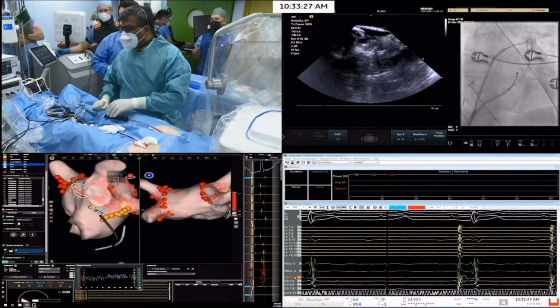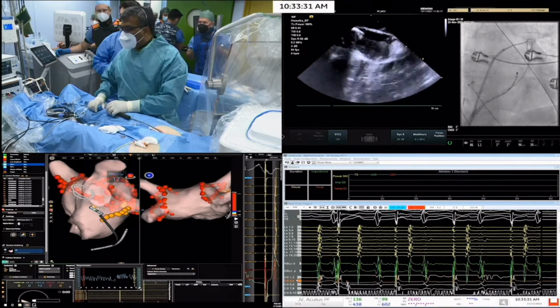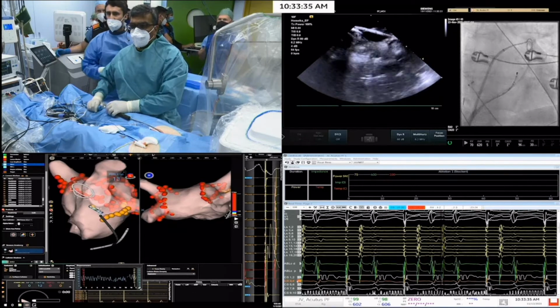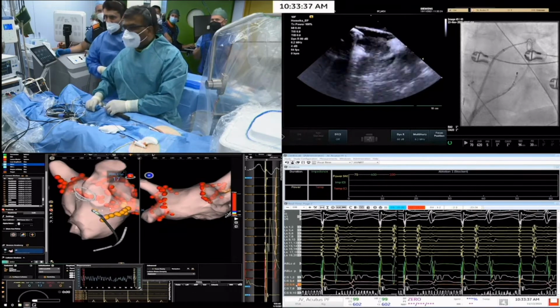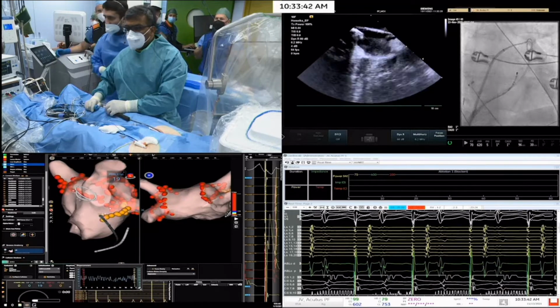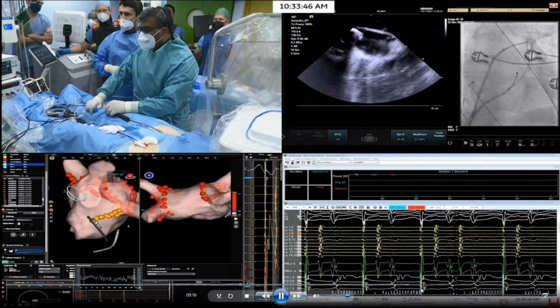But actually he needs to finish his lesion. So I hope that he will get some single lesion to add, for the line to be solid, to be continuous. And okay, here we go. I will speed up the movie a little bit.